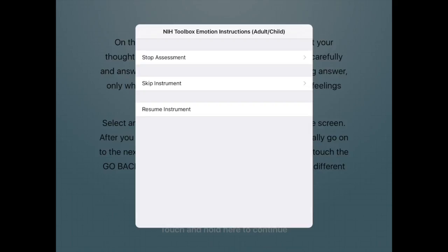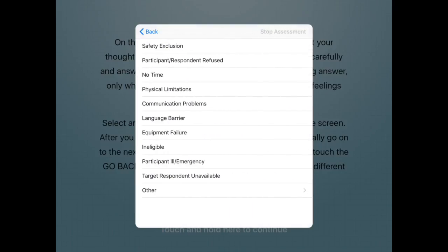Different instruments may behave differently if Resume Instrument or Stop Assessment is selected. In most cases users will be taken back to where they were before pausing the assessment. If Skip Instrument or Stop Assessment is selected, users will be asked the reason for skipping. Select the reason that best describes why the assessment is being stopped.